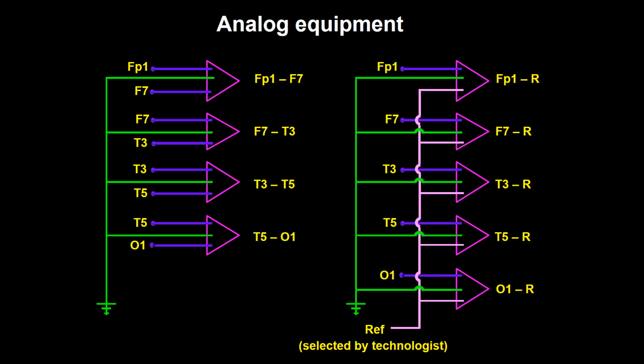As I just mentioned, the figure on your left is a diagram of a so-called bipolar montage, going from FP1 to O1. As you can see, indicated by the brackets, the same electrode used in G2 of the upper amplifier is used as G1 in the lower amplifier.